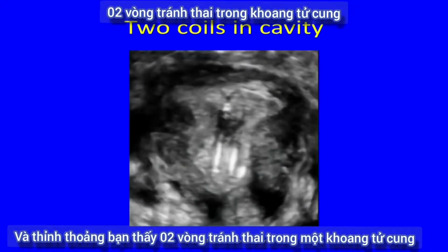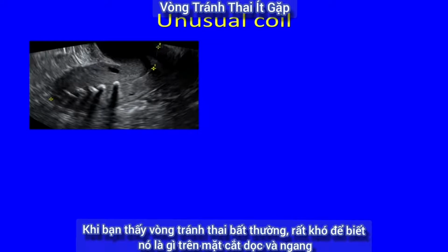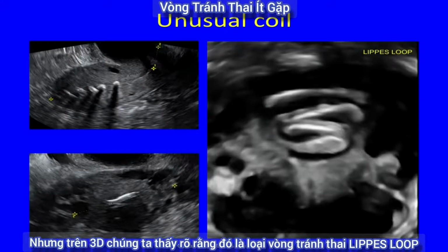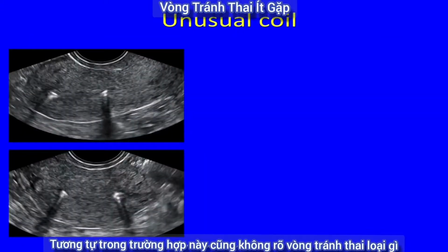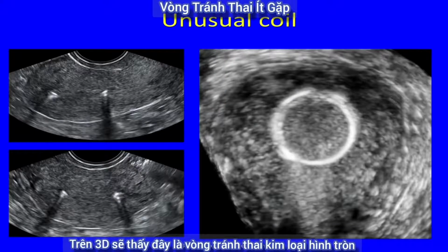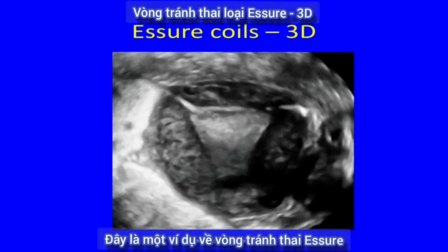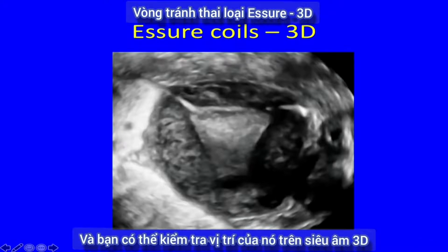And sometimes you see 2 coils in a single cavity. Or you see unusual coils. It's hard to know what this is, transverse view, but on 3D this is a Lippes loop. And again in this case it wasn't clear what kind of a coil this was, but this is a metal circular coil, and these are harder to remove. This is an example of Essure coils, which you don't see so much now, but these are small metal inserts into the interstitial portion of the fallopian tubes, and you can check their position using 3D ultrasound.